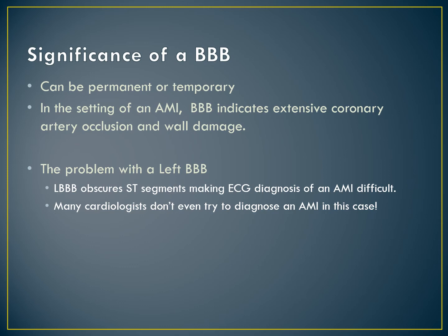It is always a good idea to ask the patient if he has a copy of a previous 12-lead that may have been taken on hand and transport it with you to the hospital. That way the receiving facility can compare and identify any new changes from the old 12-lead to the one that you printed during the call.